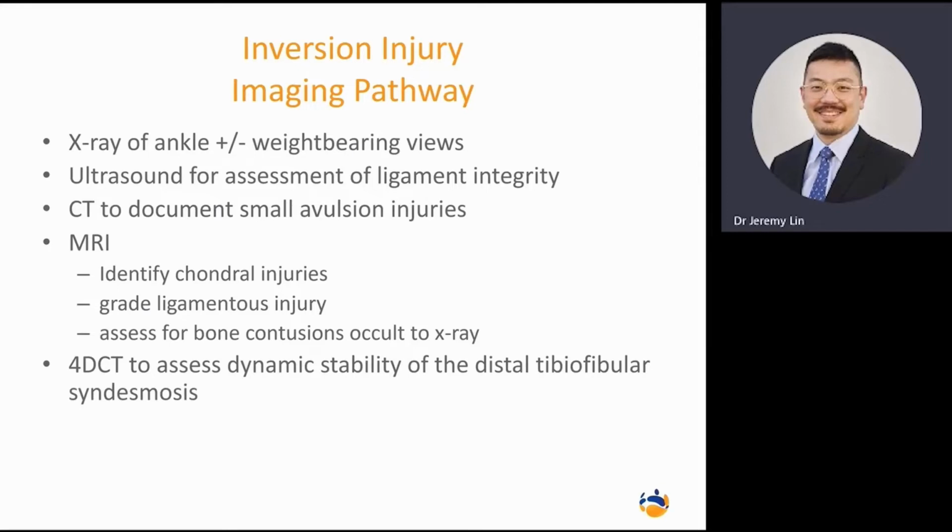CT, in my opinion, has a role. It gives better resolution of small avulsion fractures, but apart from that, you can also see severe injuries involving the ligaments, such as the ATFL. However, because usually when it's acute, everything is edematous, everything is swollen, there's joint fluid everywhere.